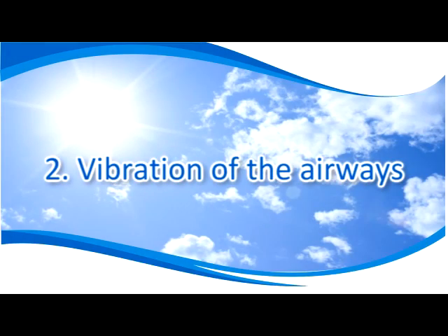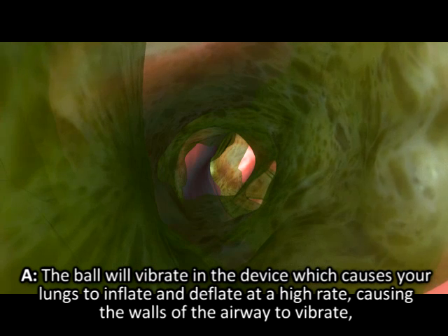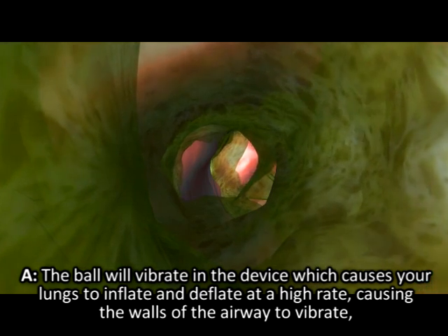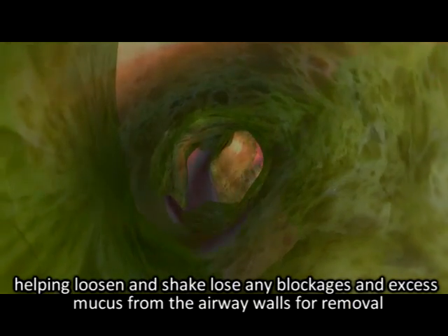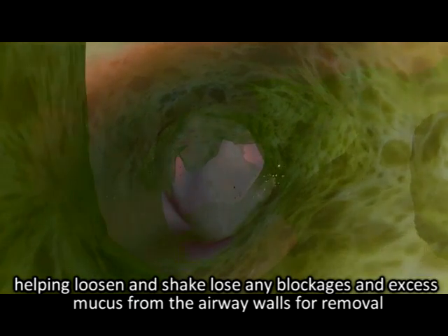Vibration of the airways: the ball will vibrate in the device, which causes your lungs to inflate and deflate at a high rate, causing the walls of the airway to vibrate, helping loosen and shake loose any blockages and excess mucus from the airway walls for removal.